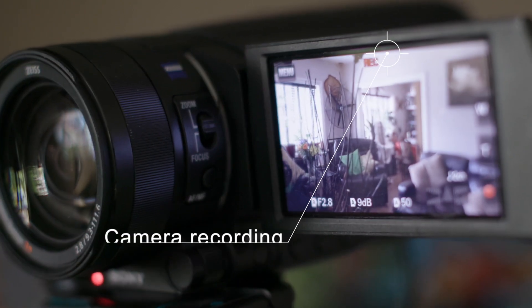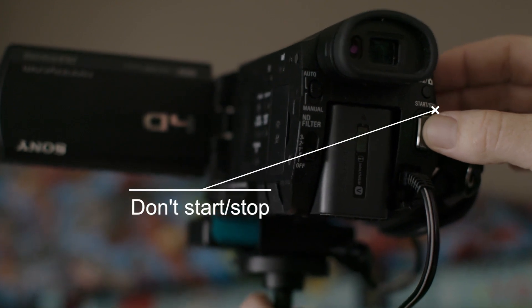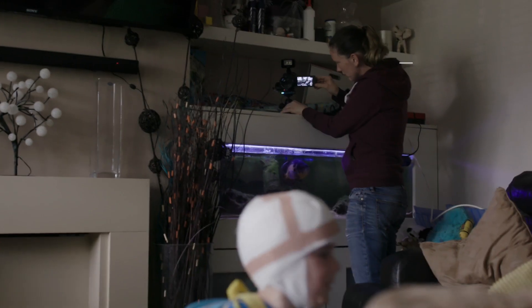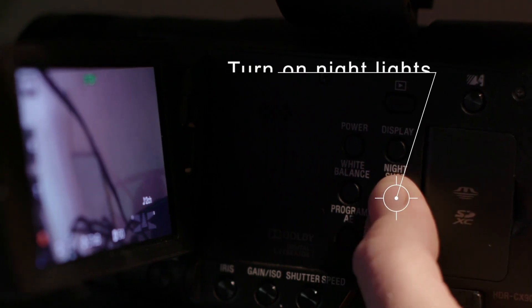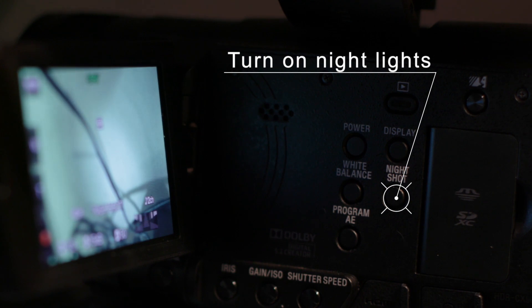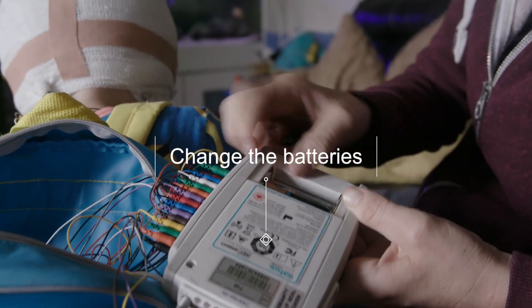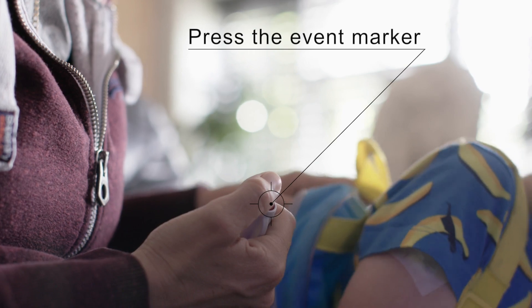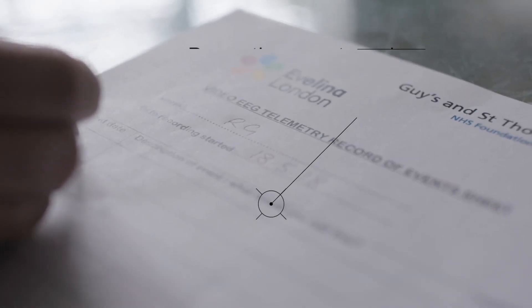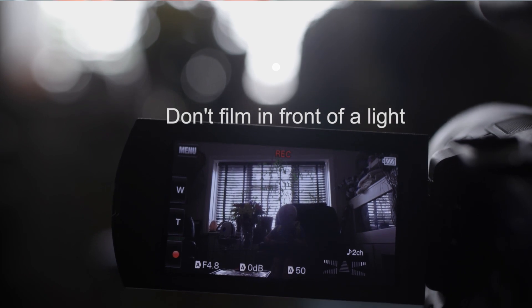Here are some helpful tips. Make sure the camera is recording. Try not to keep starting and stopping the camera. Try to keep the child in full view of the camera. At night, remember to switch on the night shot function and turn on the infrared light. Remember to change the batteries of the EEG recorder and infrared light. Press the event marker to record any events and record them on the sheet given. Make sure you don't come in front of the camera. Don't position your child in front of a light or a window.